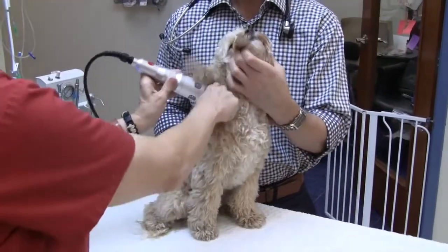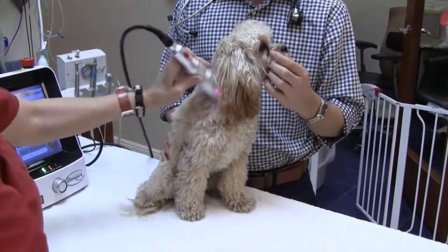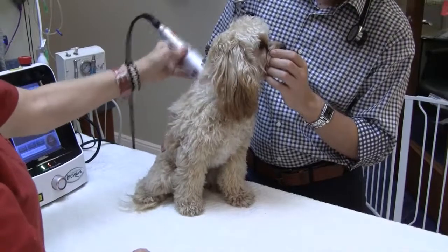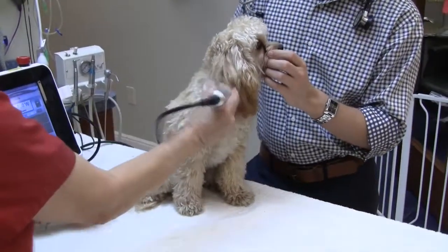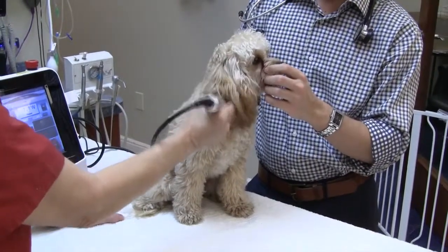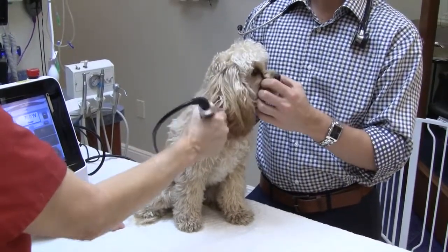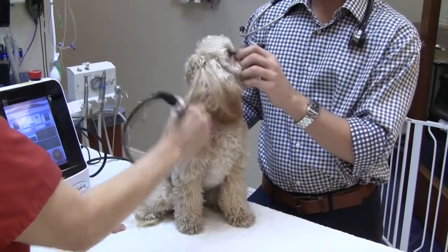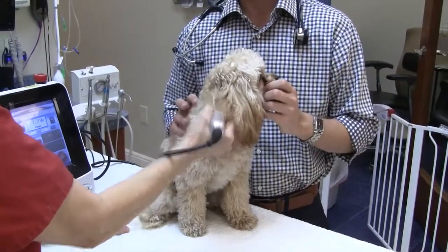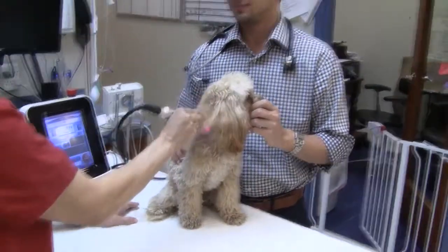The cervical spine on a dog goes down and drops deep below their scapulas, so that's why I laser down in this area, because a lot of her spine is down in here. If I just laser on top, I'm not getting as good of a treatment as I do from the side. It does help to have a patient who likes to sit still, but even with patients who don't sit still, you're still able to get a successful treatment that is worth your time and the client's time as well. ACL patients are worse, because those are your rambunctious dogs.